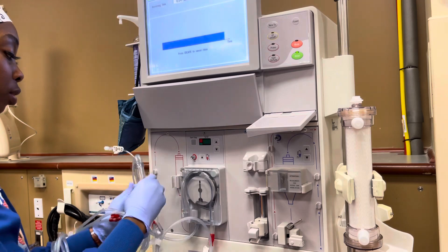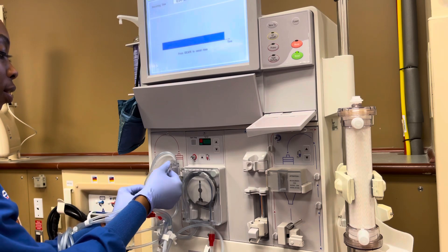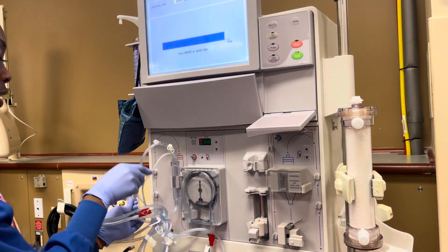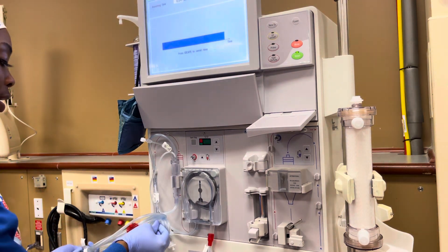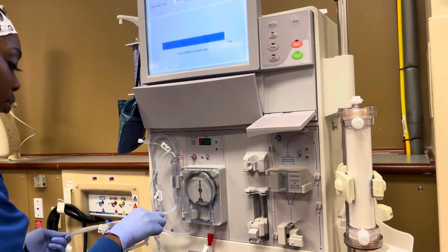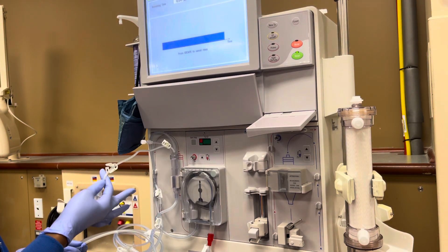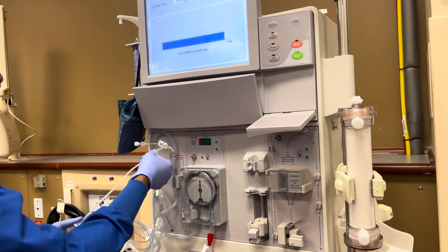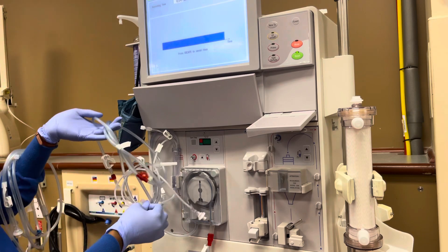Then I'm going to place my arterial chamber in, then my T — this is the T-shape — and I'm going to bring it closer. I just want y'all to see it from afar. Take off your caps. These are tangled inside and you want to clamp everything — close your clamps as you're going. So this one you definitely want to close.